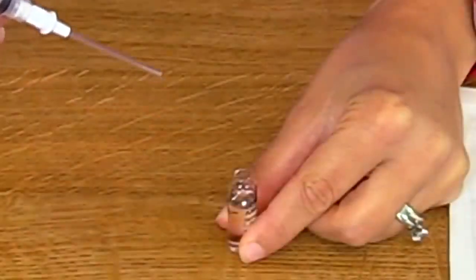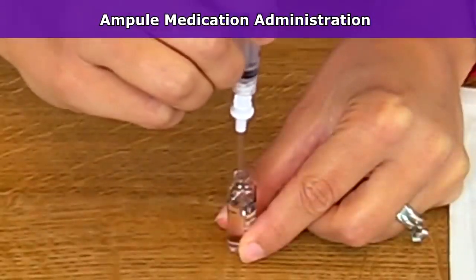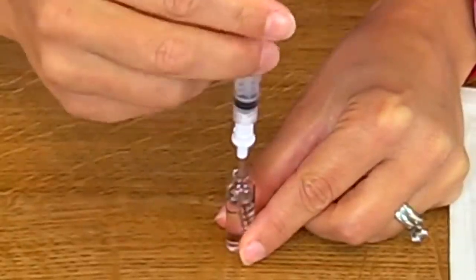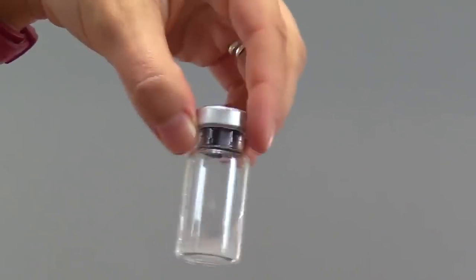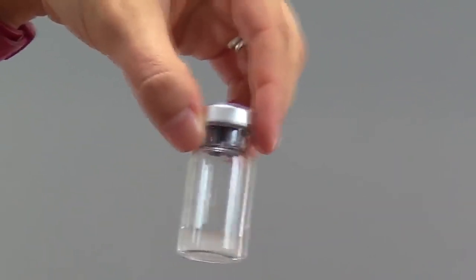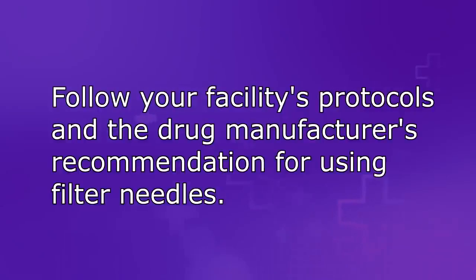Now, whenever you're withdrawing medication from a glass ampule, you'll always want to use a filter straw, and I actually have a video that you can check out where I demonstrate how to do this. But some medications that need to be reconstituted from their powder form and removed from a vial may need this. You want to check with your facility's protocols and the drug manufacturer if a filter needle is needed to withdraw the medication from the vial.